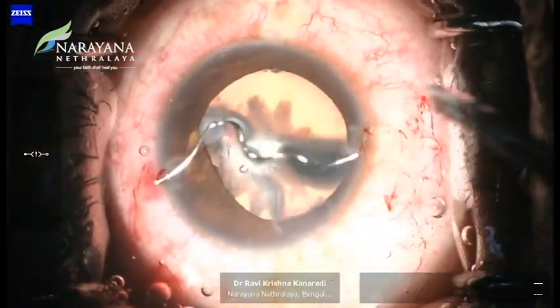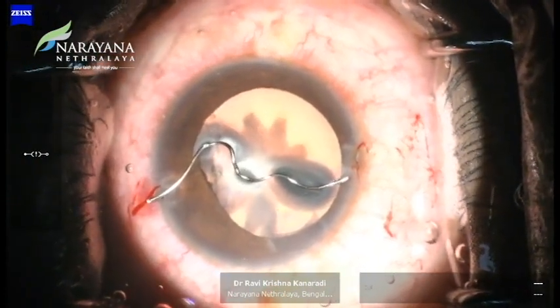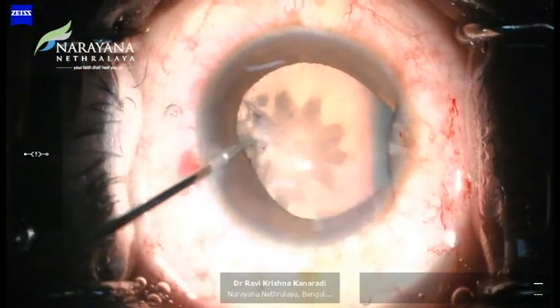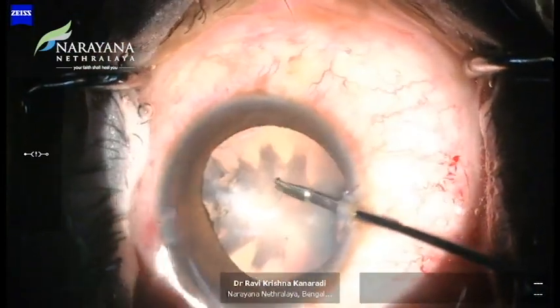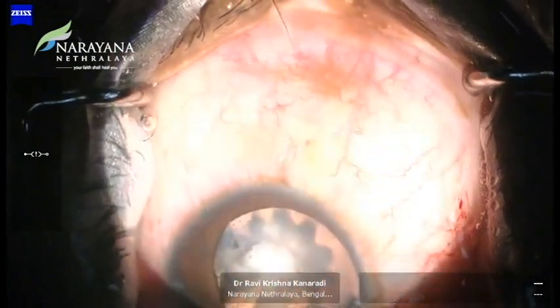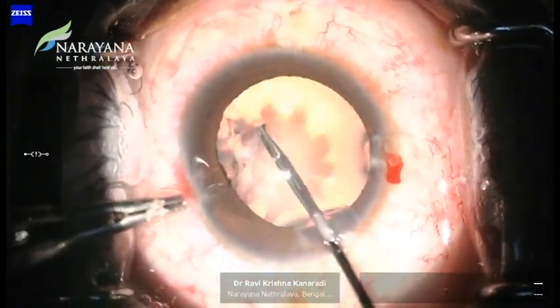With the foreign body now out, we decided to go ahead with phacoemulsification, keeping in mind the sealed corneal wound. A radial tear was created with the micro-scissors at the point of the pre-existing breach by the wire. Micro-rhexis forceps were used to complete the rhexis, as they provide enhanced stability.